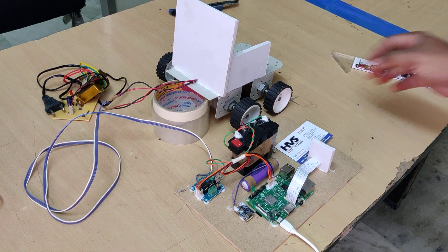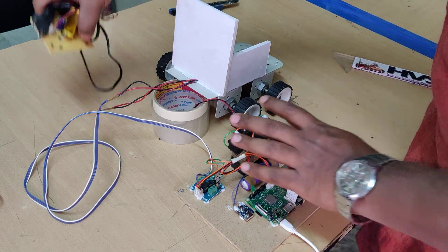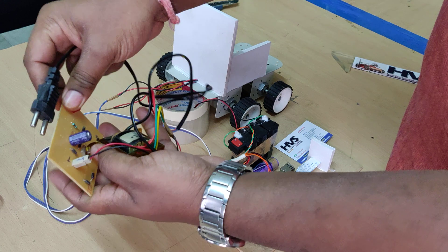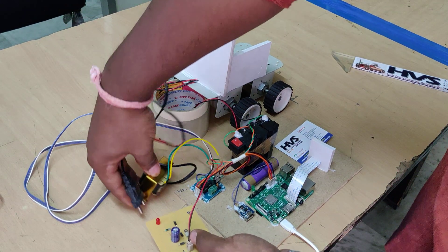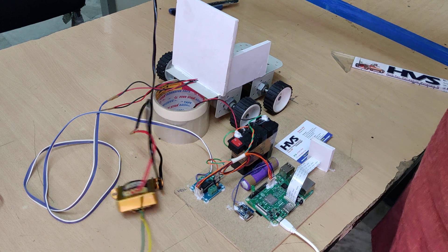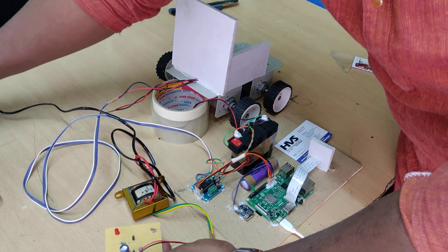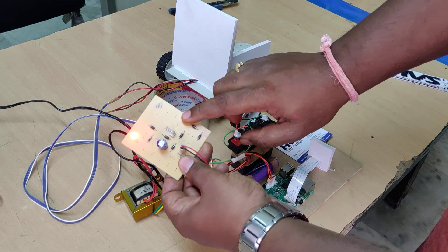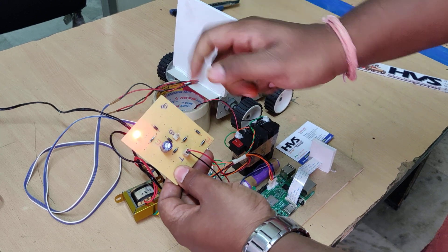Let me explain the charging process. This is the main charger for the 12V 1A battery. This transformer steps down 230V AC to 12V AC. Connect this cable to the 230V input, and the transformer steps it down. This regulated power supply board converts 12V AC to 12V pure DC, which is sufficient to charge the battery.